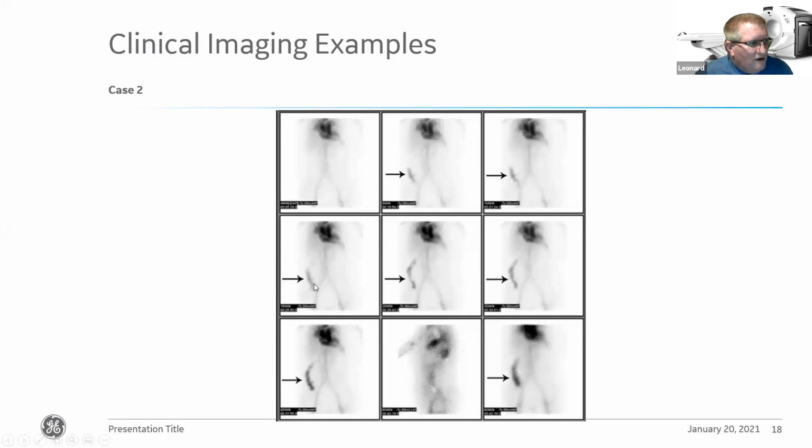As we acquire that over a period of time, you can start to see where the actual uptake is going. Again, we've got a lateral image to try and show exactly where it's located, but that then equates to where we're actually seeing active bleed within this patient, okay?